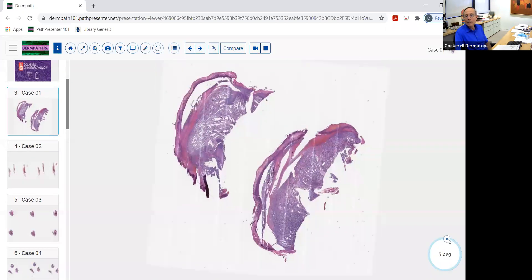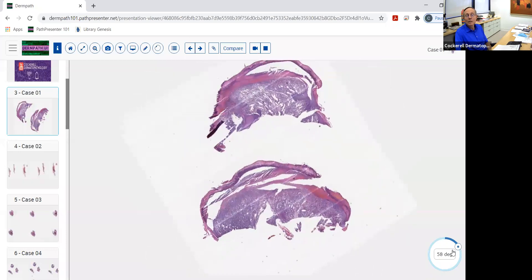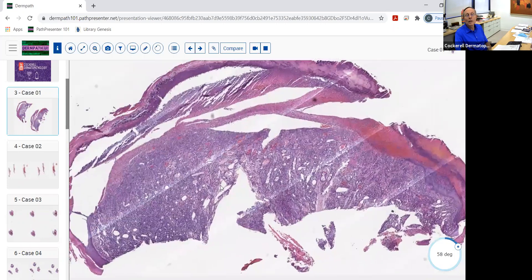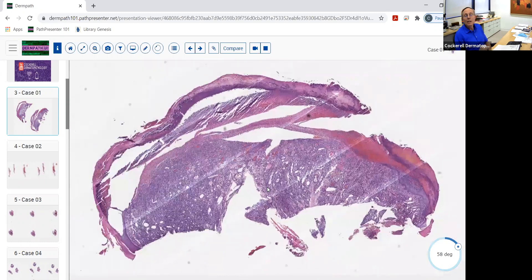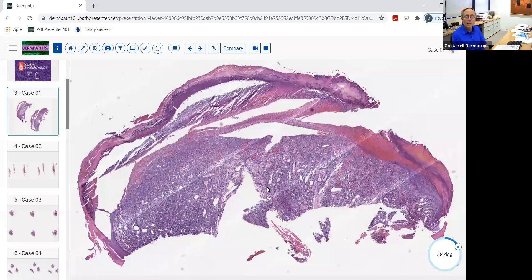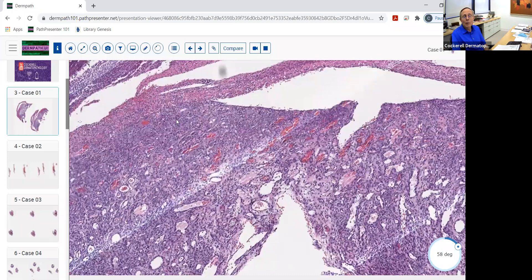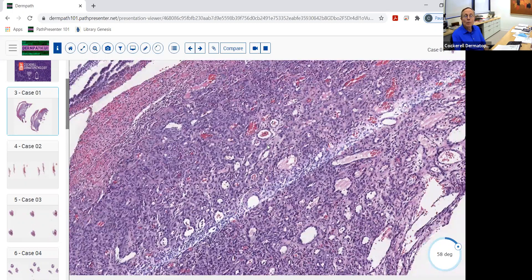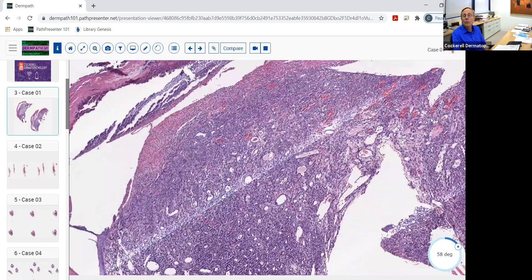The first one we're going to look at is a fairly common one: pyogenic granuloma. You can see it's a shave biopsy here. This is very typical of what we see with pyogenic granuloma. They're usually clinically reddish, crusted lesions that are often sent in to rule out basal cell or possibly a vascular lesion, and often seen on the extremities of young individuals. At higher magnification, they're in the family of lobular capillary proliferations — lobules of capillaries that proliferate, with inflammation and crusting associated.